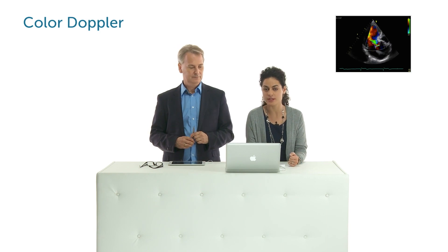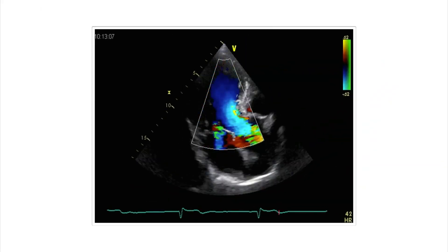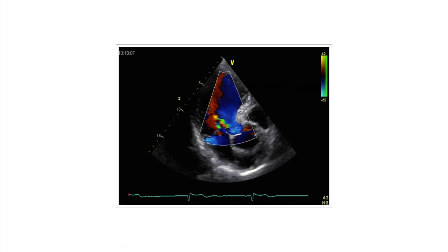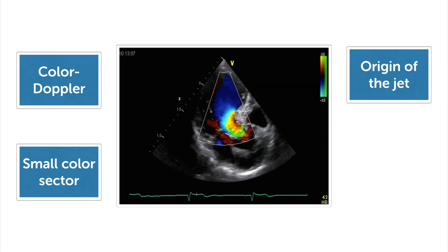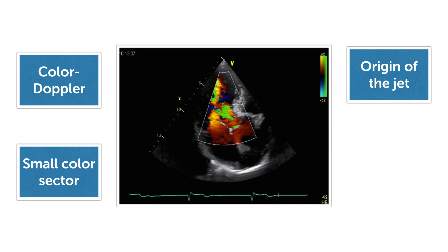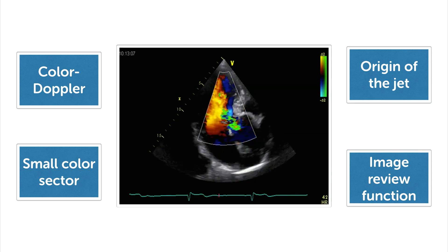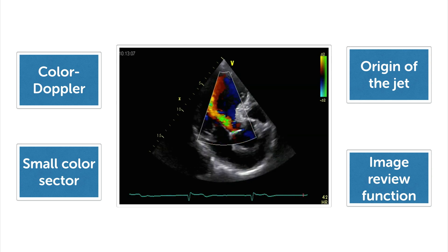How do we detect AR? With color Doppler. Like we do with mitral regurgitation, we have a JET, but here it is originating from the aorta and goes through the aortic valve into the left ventricle. When using color Doppler, a few tips: make sure the color sector is small, try to always visualize the origin of the JET — which is more difficult than for mitral regurgitation — and use the image review function. Freeze your image and scroll it back and forth to analyze the JET completely.